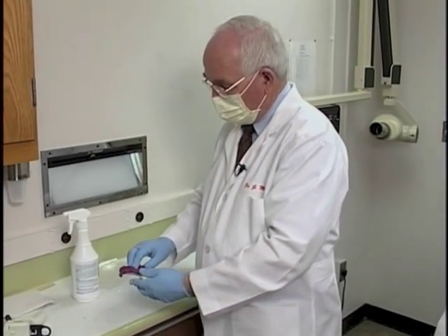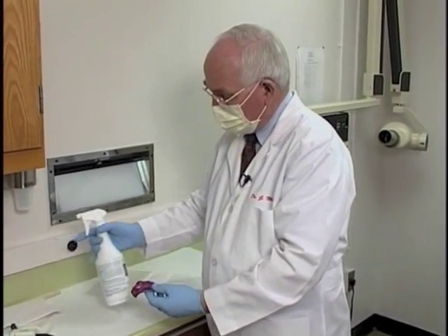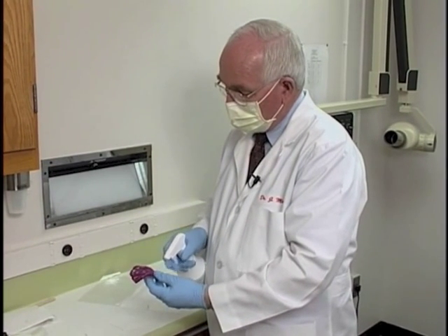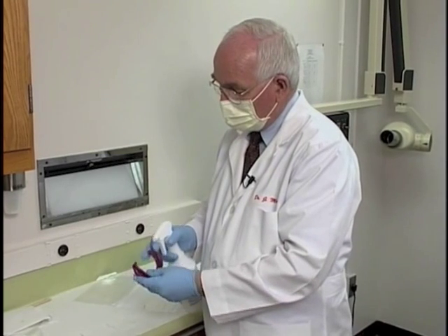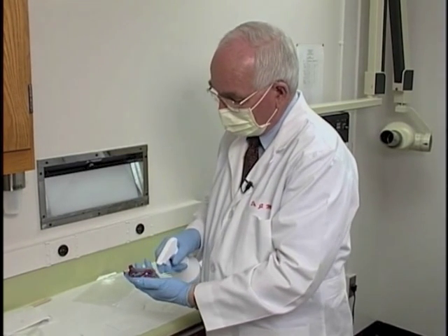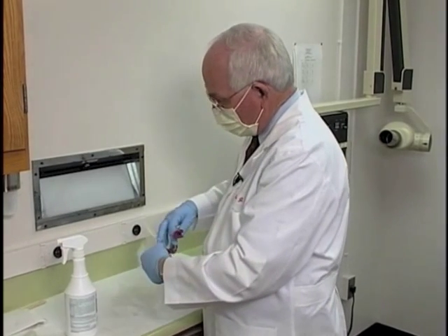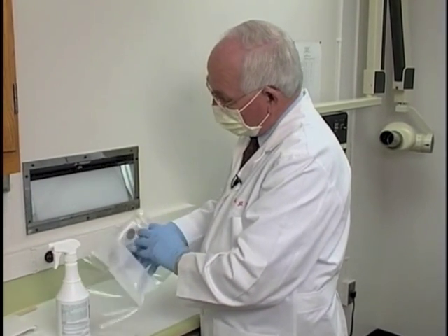Now that we have an acceptable impression, the next thing we need to do is to disinfect the impression with a surface disinfectant. So we spray it real good with a surface disinfectant and place it in a bag for transportation to the laboratory for pouring.